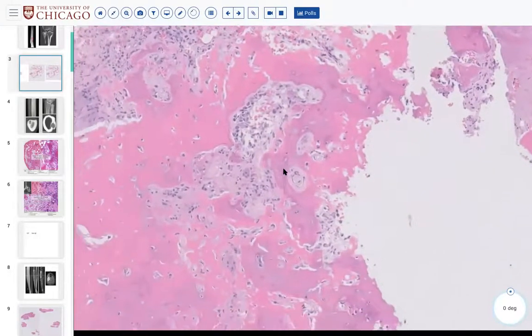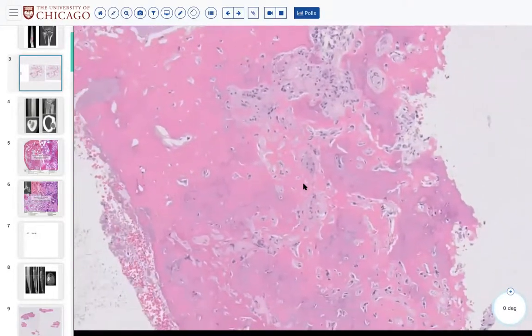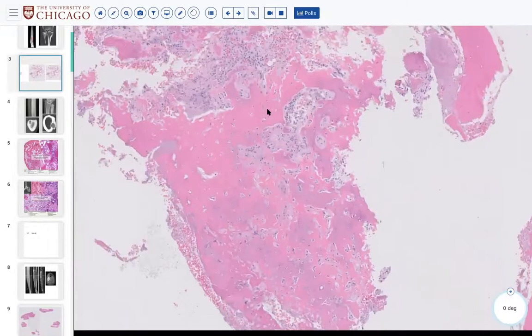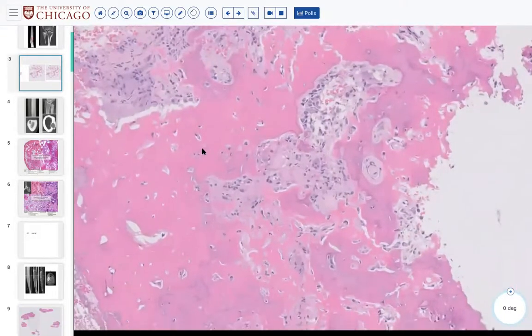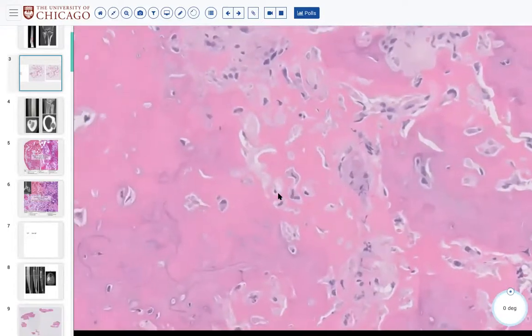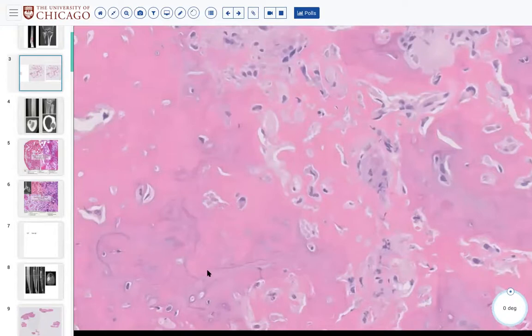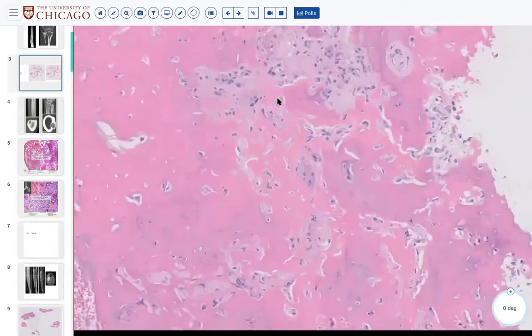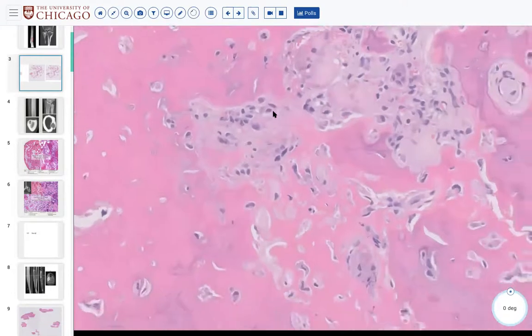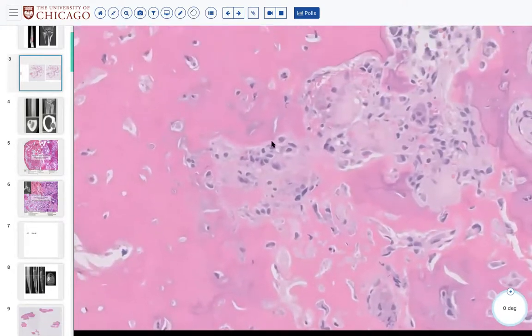So, looking around, what do we have here? Mature bone or woven bone? Not lamellar bone. Right, not lamellar bone. So you see very fine lacy osteoid without very discrete parallel lines. Maybe you see some intersecting lines, but not much. The osteocytes here are also present in the lacunae, right? So this is also still viable. And if you are keen, you may identify some small cells lining up here at the edge of the bone. What is this called? Osteoblast.